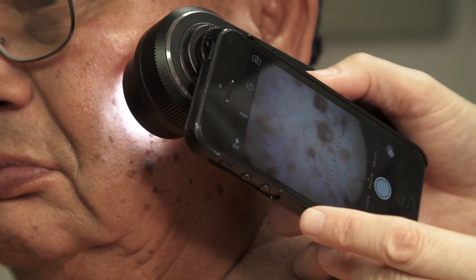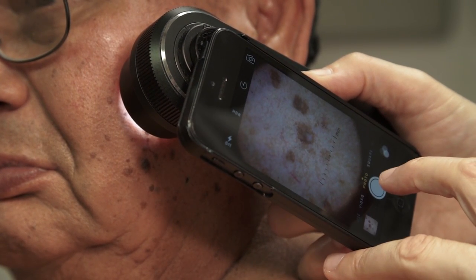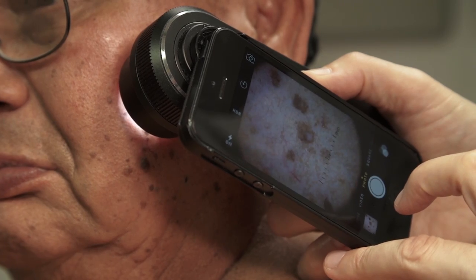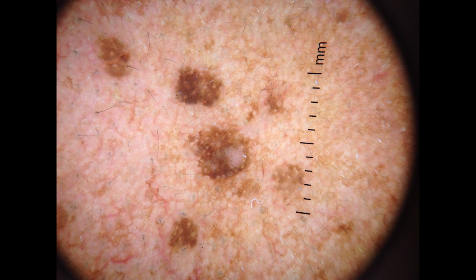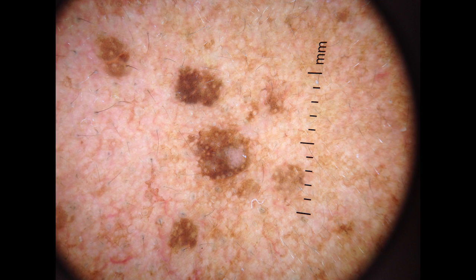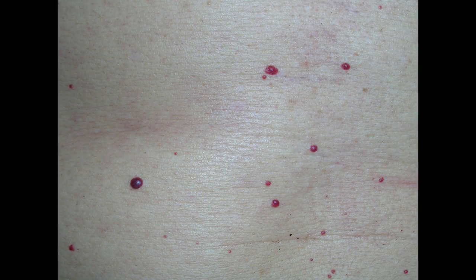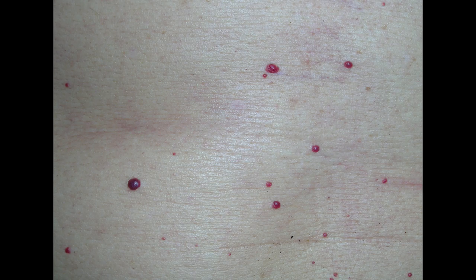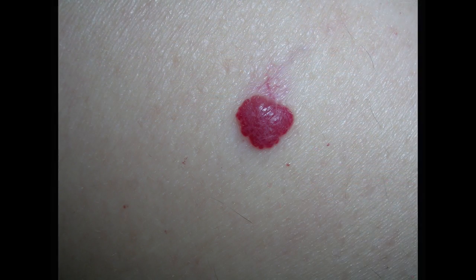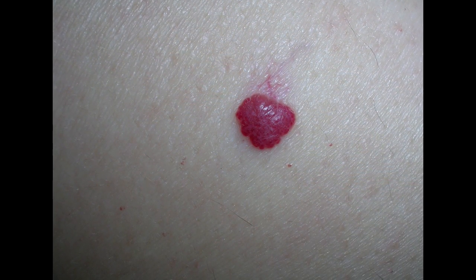Here we are looking at a seborrheic keratosis on the face using a DermLite 3 attached to an iPhone. Typical features of solar lentigines and seborrheic keratosis are visible so that no biopsies are needed. Many vascular lesions in older adults are benign cherry angiomas. Sometimes a vascular appearing lesion is suspicious for a skin cancer.